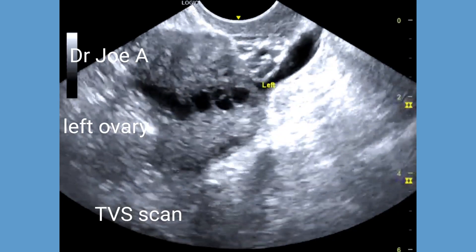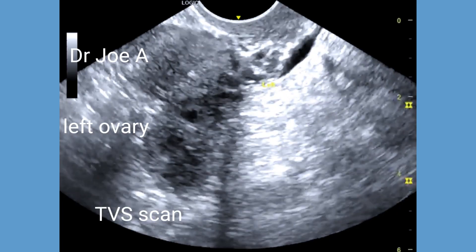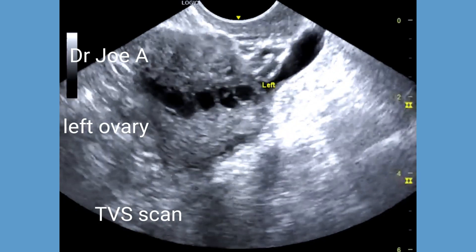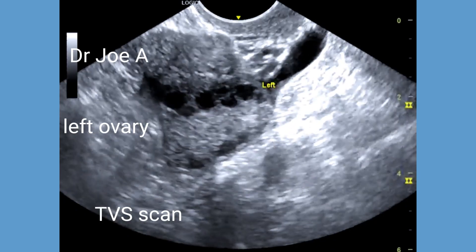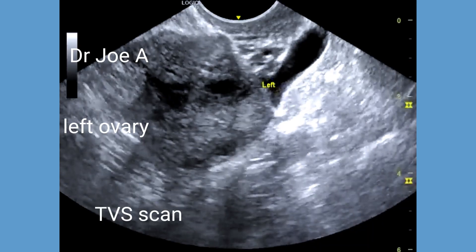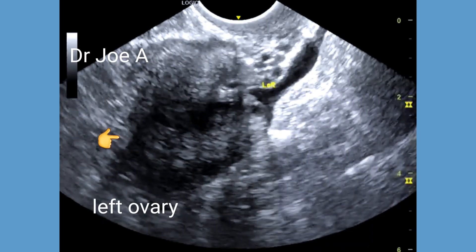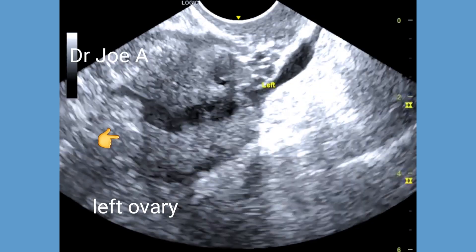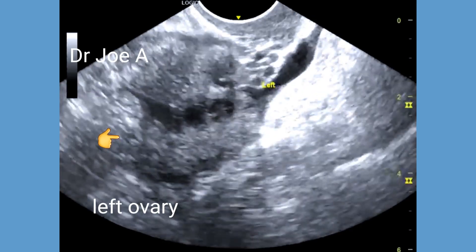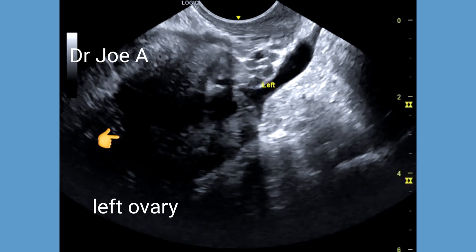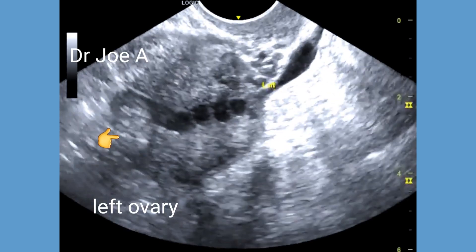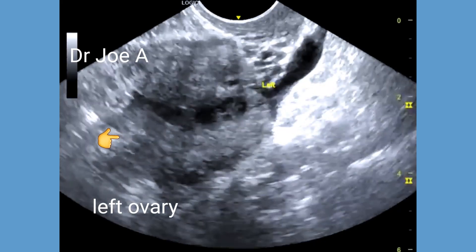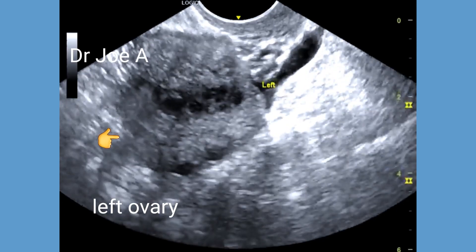Transvaginal ultrasound also confirms the above findings. There are multiple follicles along the rim of the left ovary with a grossly enlarged ovarian volume. Probe pressure produces mild tenderness over the affected ovary.